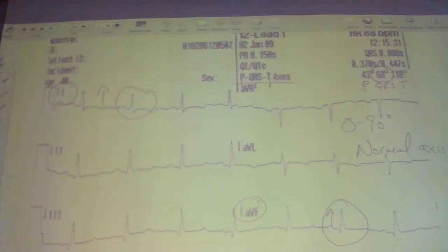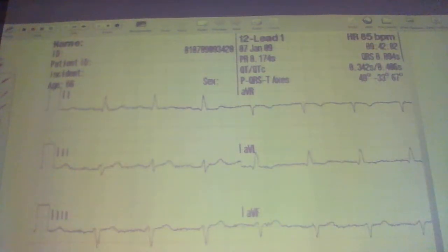All right, so the quick cheat here is that you can always do the 12-lead EKG and take a quick peek at the number that's here. The EKG machine does do a pretty good job of that. The computer interpretation isn't so reliable, but these are usually pretty reliable. We'll talk more about that in a different video. So let's take a look at another example here.